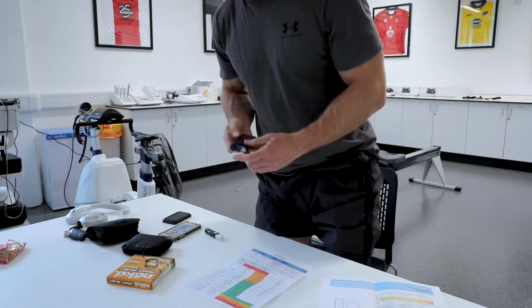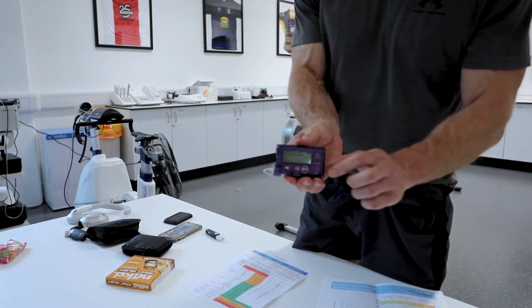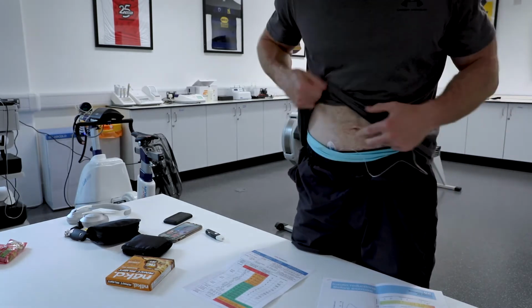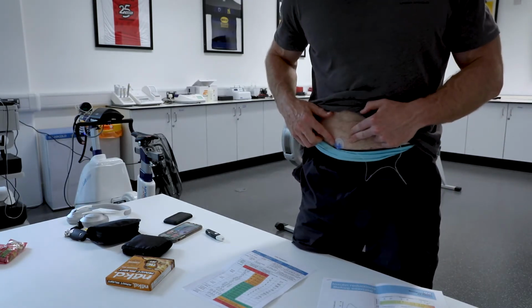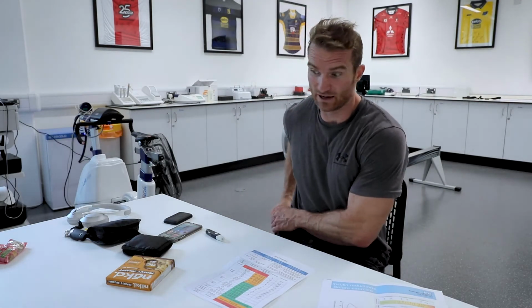You should be able to see that that says 1.5 units. Press Act. And that's now delivering that 1.5 units into my cannula site. I'll wait 15 minutes, I'll eat the food, and then after 45 minutes since the insulin's gone in, I'm going to start to row.